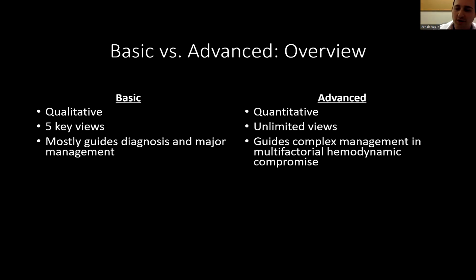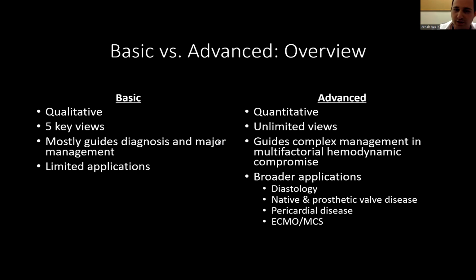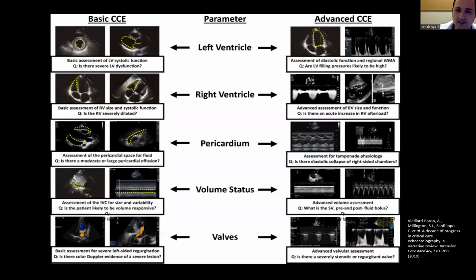At the same time, if you are interested in taking it to the next level, then at the advanced level, you're able to guide more complex management, choosing your pressors and inotropes, maybe identifying a dynamic LVOT obstruction, which will completely change your management. And so for that reason, basic echo is important, but has limited applications, whereas advanced echo has broader applications, especially when you're starting to apply it to diastology, native and prosthetic valve disease, pericardial disease, or ECMO and patients on MCS.